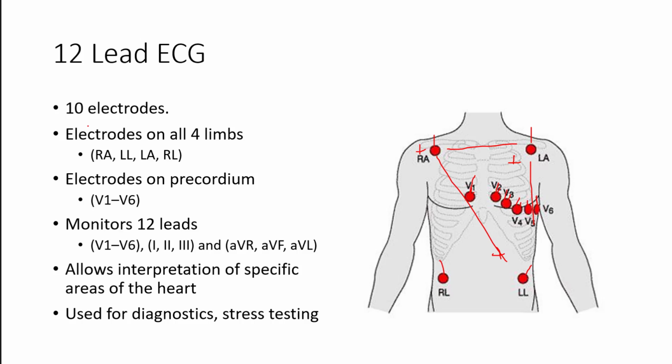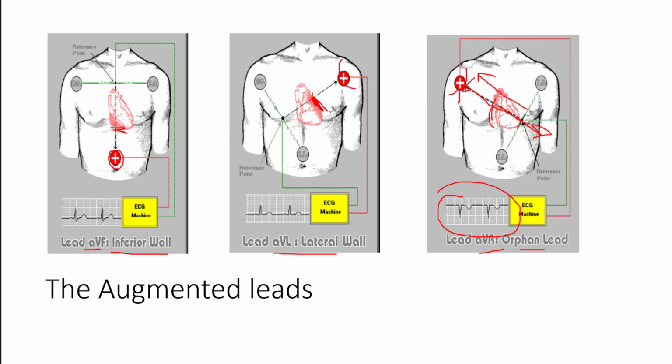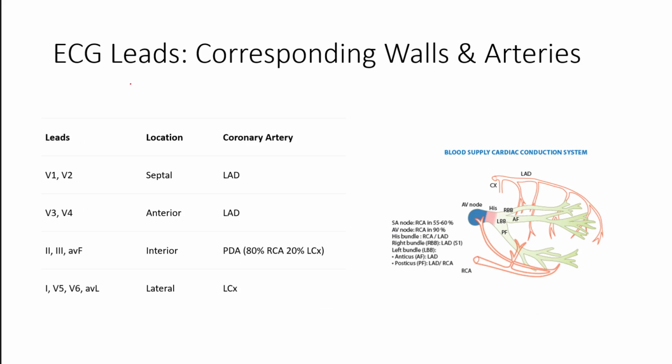And again, this is primarily looking at the left ventricle, right? Given how we've oriented the heart, but that's super important. Again, it's the structure for looking at how we're pumping blood and perfusing our body. Now, you might have noticed that we have some redundancies. Like I mentioned, there are certain views that look at different parts of the heart, right? So again, our V1 and V2 look at the septal regions of the heart, given how they're oriented. Go back to this one. V1 and V2 look more at the septum. V3 and V4 look at more of the anterior wall.